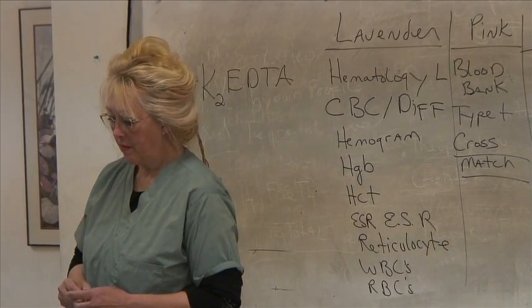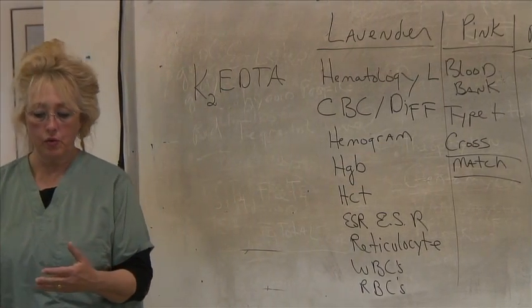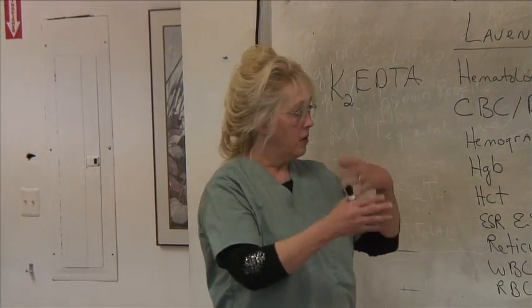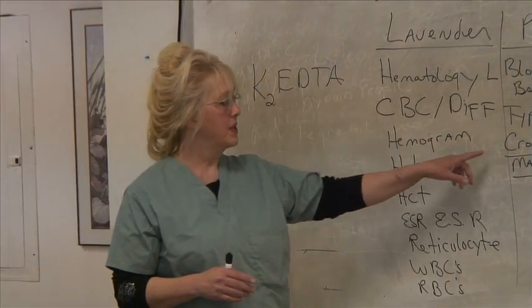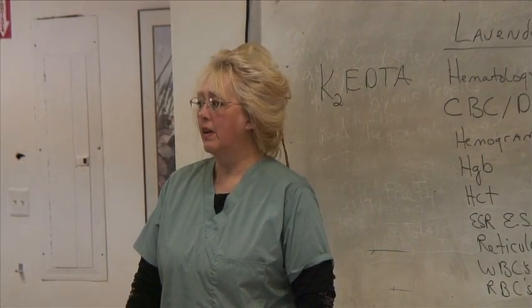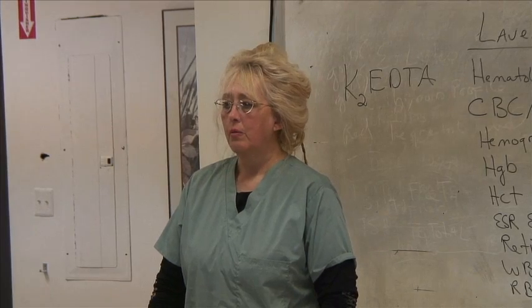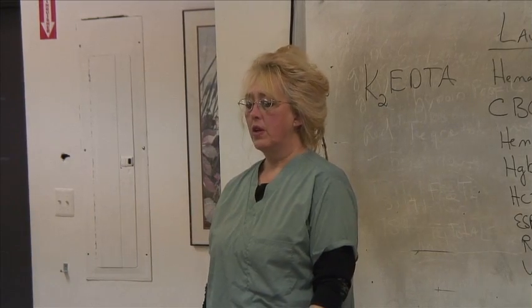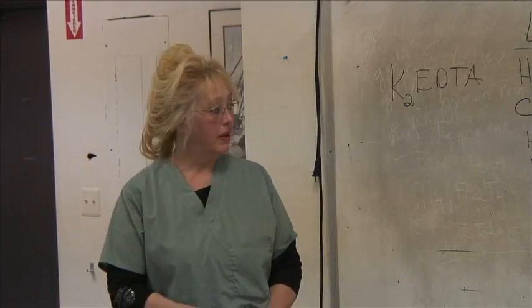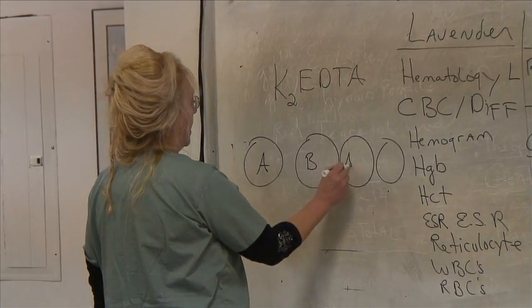As I might have mentioned in a previous lecture, if you pull somebody else's blood, you label the tube before you get into a room, as opposed to labeling the tube after you've drawn a patient's blood, and you guys get it mixed up, and you went to do a hemoglobin and a type and cross, and you send down somebody else's blood. If we start to transfuse the wrong blood type, it only takes a few milliliters of that incompatible blood to cause someone to have a reaction. That could cause a sentinel event, because mismatched blood types will cause your body to make antibodies against the foreign antigen. Okay? Typically, if you take a look at blood typing, we have A, B, AB, and O.